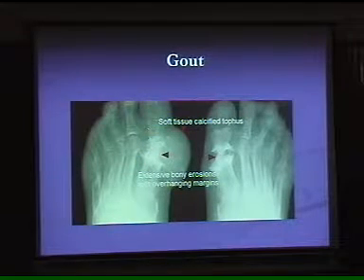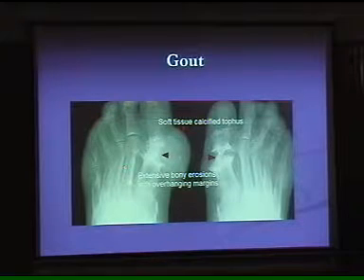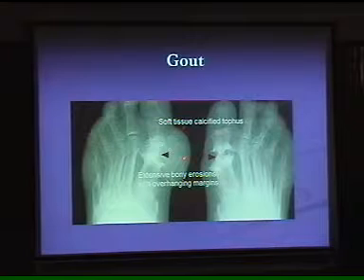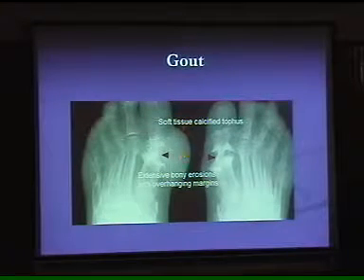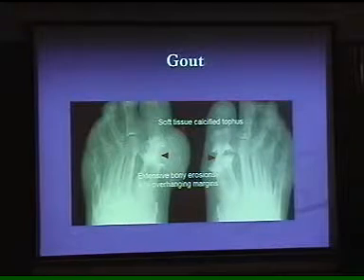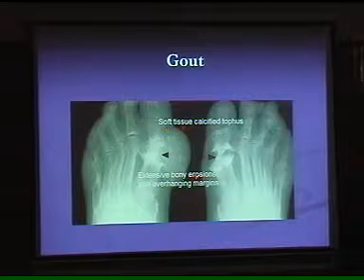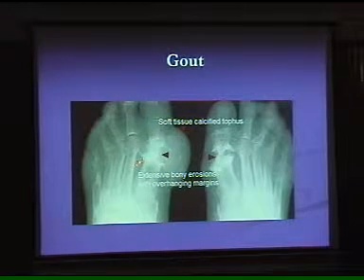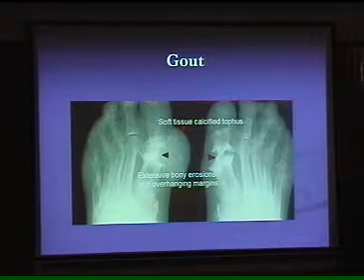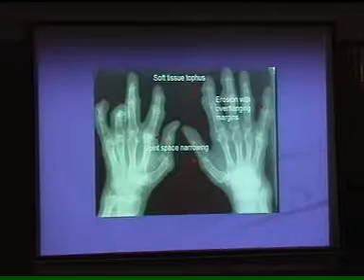Sometimes a diabetic foot may present like this, but again that's going to involve these phalanges, the most terminal phalanx. If you look at this bone over there, it is irregular, there are soft tissue calcifications, a soft tissue mass as well, and soft tissue edema. This is known as eccentric swelling, whereas in rheumatoid arthritis there is fusiform swelling. One side is swollen, the other side is absolutely normal. That is a diagnostic sign. Soft tissue calcified tophi you can appreciate over here, and irregular margins of the bone damaged by the disease. Serum uric acid is high, which is diagnostic.